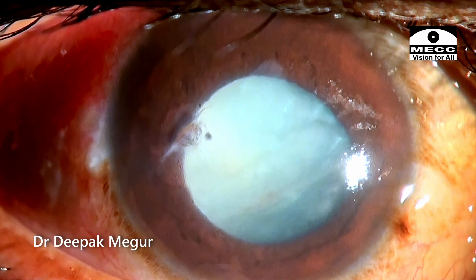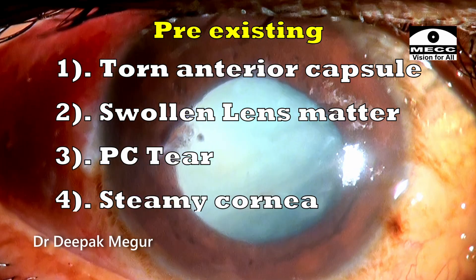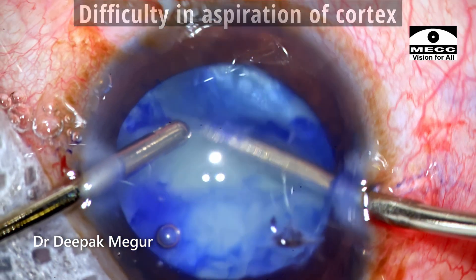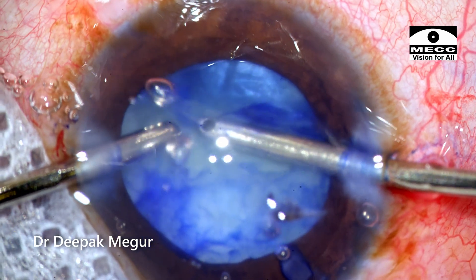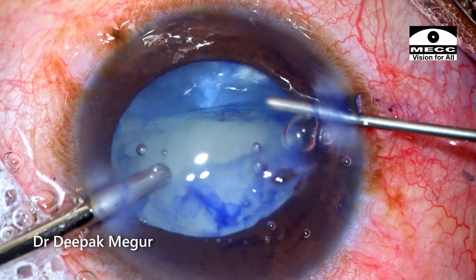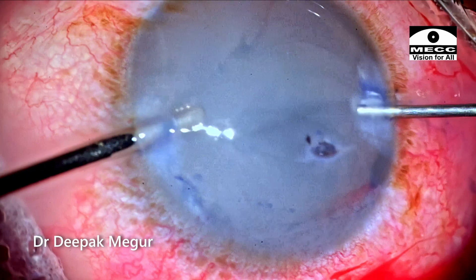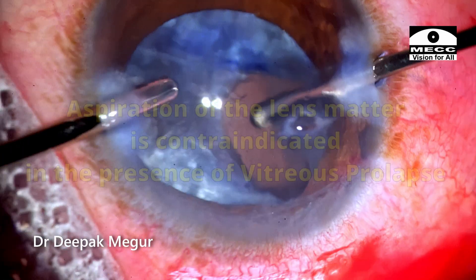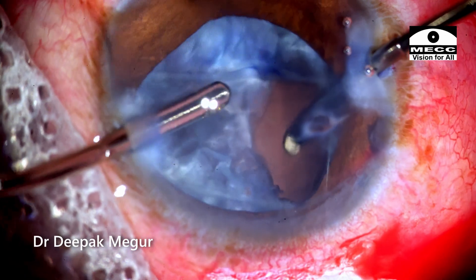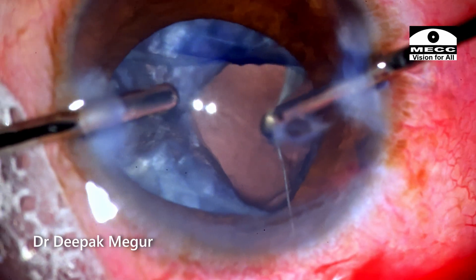To conclude, this was a very tough case — a combination of anterior capsular tear, swollen lens matter, and posterior capsular tear which was not visible at all. The cornea was extremely steamy and one of the first clues that vitreous disturbance could have happened was the difficulty in aspirating the swollen cortex. That was indirect evidence something was not right. It could also be inflammatory membranes, but this should raise an alarm that there could be a hidden posterior capsular tear with vitreous prolapse already present.